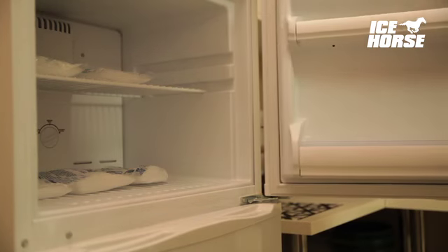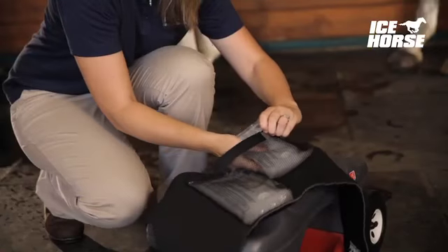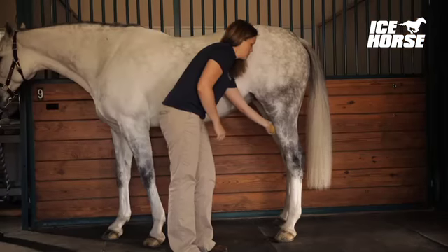To apply, begin massaging your frozen First Ice pack for about 10 seconds. Then place your packs in the inner sleeves of the wrap. Using cool water, sponge the area to be treated.